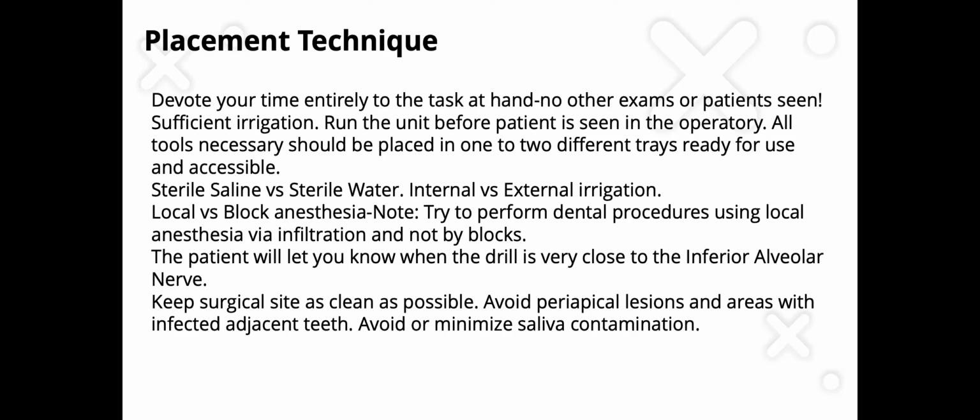Local versus block anesthesia. I know that when you're placing a dental implant in a traumatic extraction site immediately, you're going to be using blocks for the lower mandible. But if you are going into a healed site and you're placing your implant in the lower mandible, try to just use local anesthetic infiltration in that area.